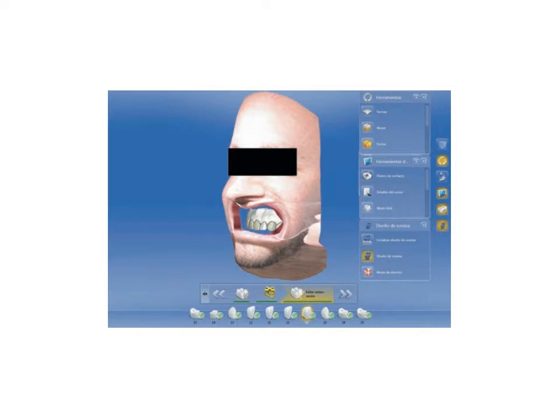Scanned 3D images of the face and the dental arch are correlated to make a digital design that then must be materialized, so that the patient gives his approval or disapproval to avoid inconveniences with the final result of the treatment. These results can even be integrated directly into the digital workflow, designing and machining the mock-up, temporaries, or even the final restoration using CAD/CAM technology. In order to evaluate the result, the mock-up can be presented to the patient.